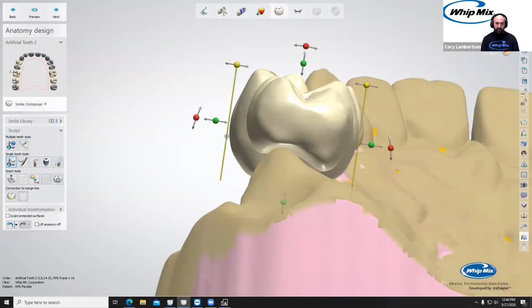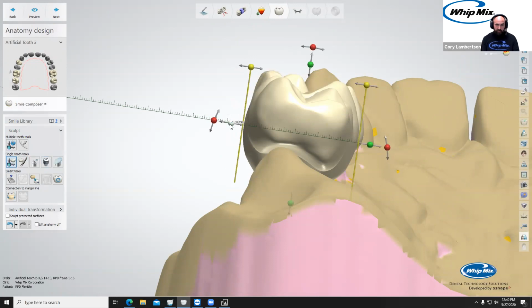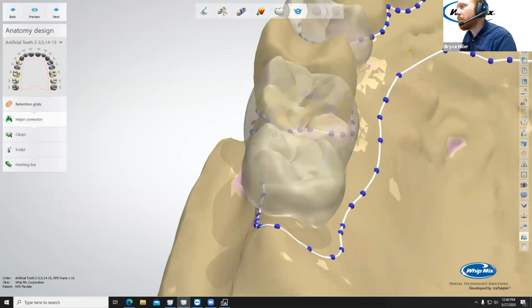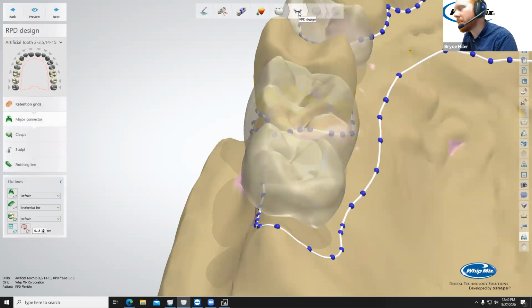While you're doing that, we had a question come through. It says, "Hey guys, what material are you planning on using here and is it flexible?" Really not going to talk about a whole lot of materials today, to be quite honest.